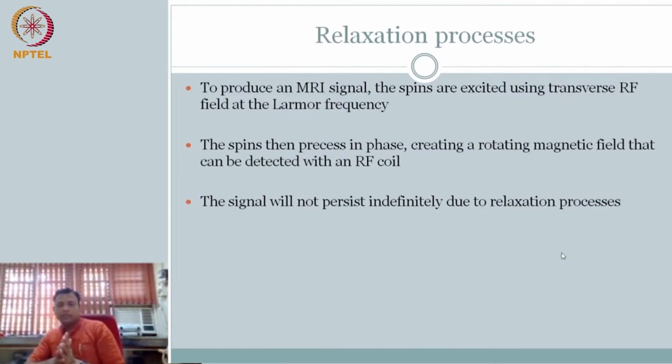So naturally, we need to talk about how it is losing signal strength. In the relaxation process, how can it lose signal strength? One is dephasing. The moment it starts to dephase, you have a lack of signal coherence, and therefore a lack of signal. The signal is dying down. That is your transverse component.